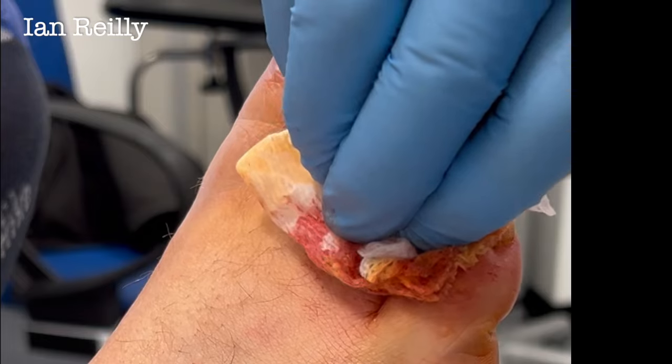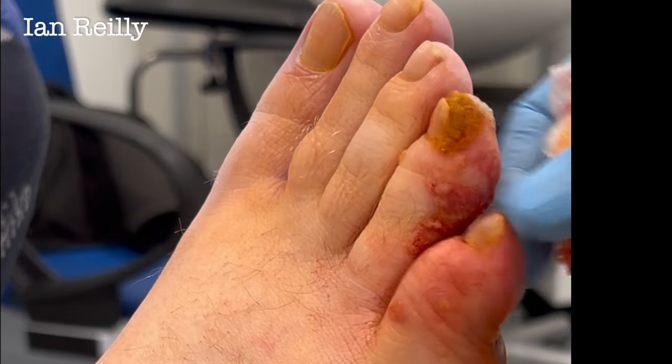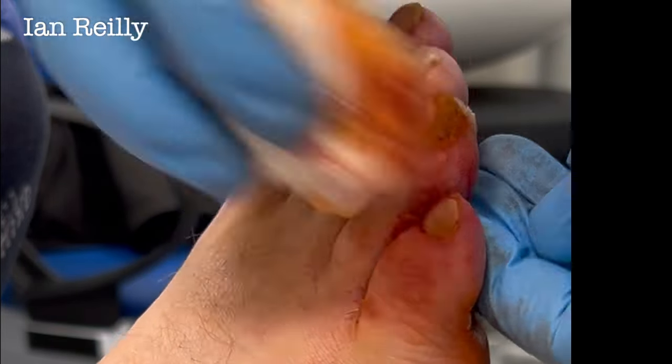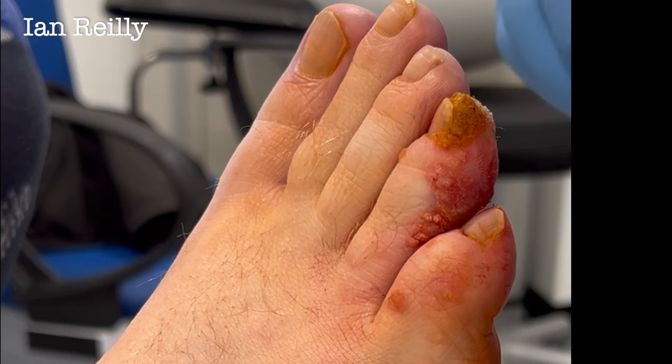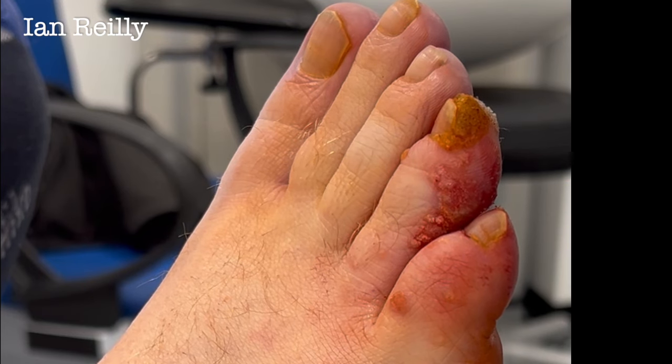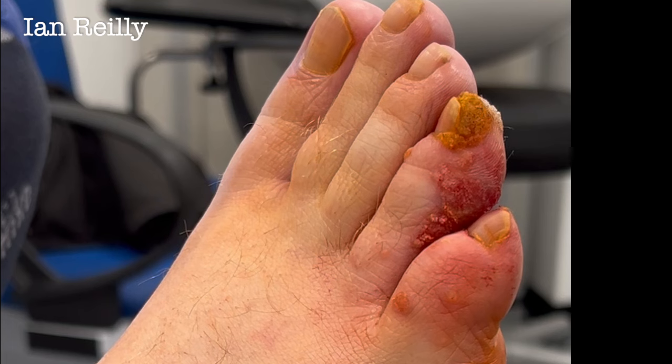We're just going to put a light dressing on that. A little bit of pinpoint bleeding — we'll keep you covered for today. As you can see, it's not really much of a wound, but it can just be a little bit sore. We'll see you back next week — we'll take the callus off, and then review in two months to see how you go.